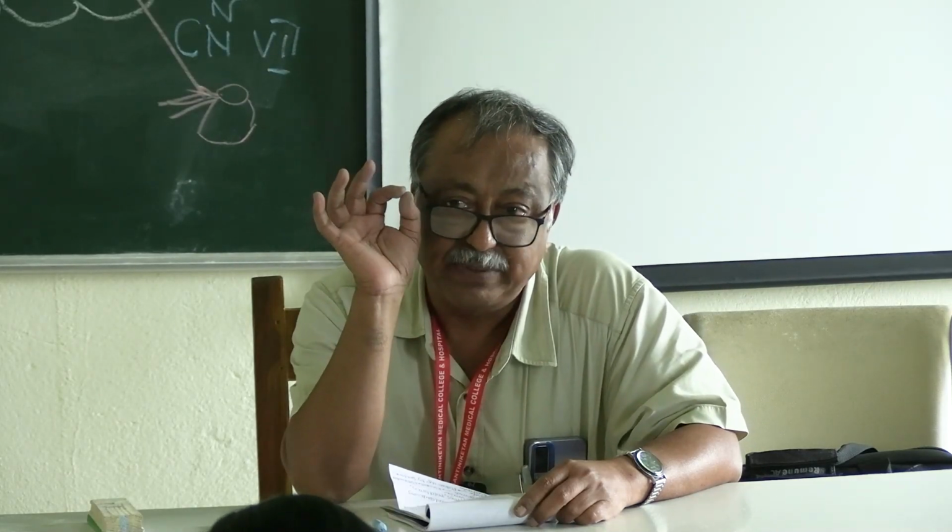Abnormal: it is the absence of acoustic reflex with normal tympanogram. Tympanogram is normal, means the ossicular chain pattern is normal, but the stapedial reflex is absent. That is the profound hearing loss, because the retrocochlear portion, the message is not coming.